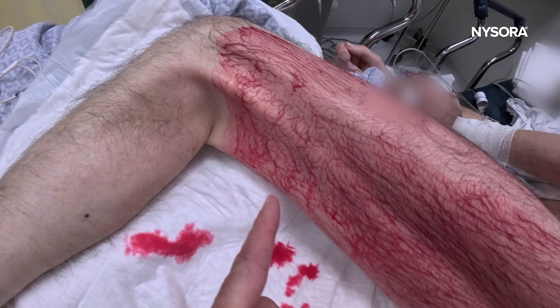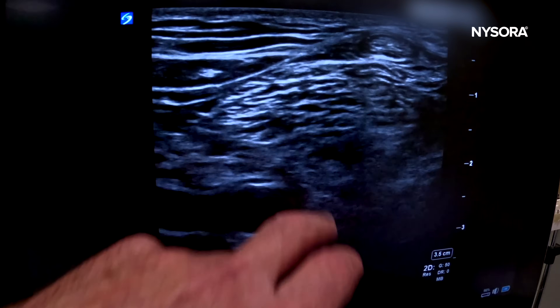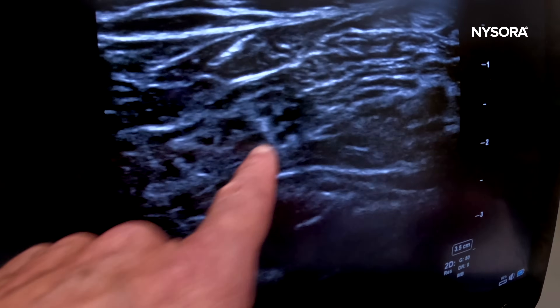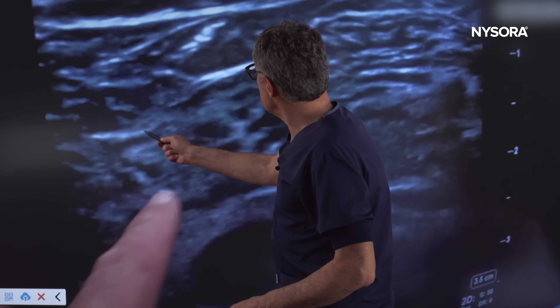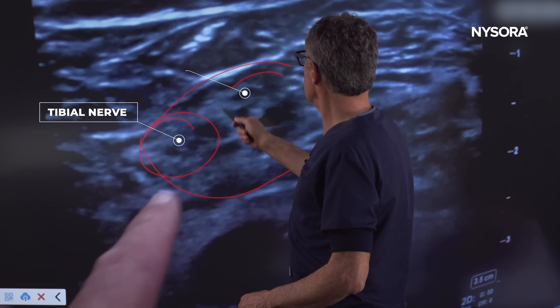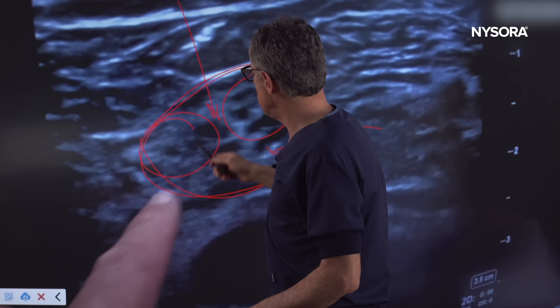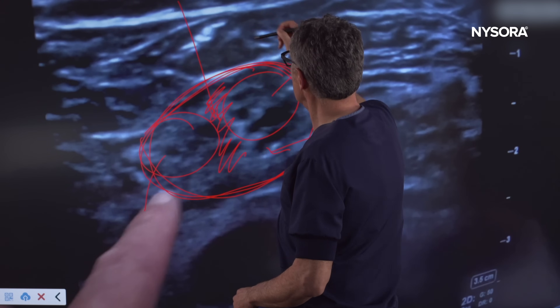Here you can see the entire anesthetic trajectory. Let's look at the popliteal fossa first to get an orientation. The tibial nerve is right there. Here is the image of the sciatic nerve in the popliteal fossa. That structure is the Vloka sheath, which envelops the entire sciatic nerve — the tibial nerve and the common peroneal nerve. When you see this configuration, insert the needle in-plane or out-of-plane and inject local anesthetic to separate these two nerves inside the common Vloka sheath.